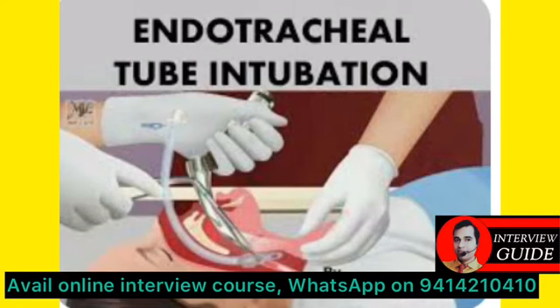After we are able to visualize the glottic opening and the vocal cords, we take the endotracheal tube and start inserting it into the mouth of the patient from the right side. We put the tube into the glottic opening and insert it until the cuff has gone below the level of the vocal cords. After reaching there, we remove the laryngoscope blade.